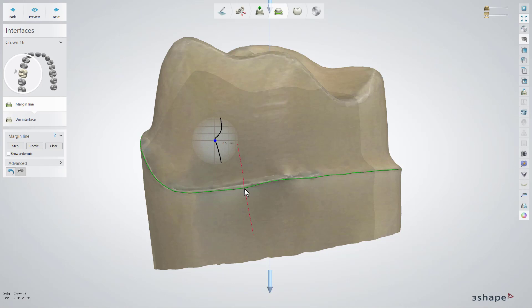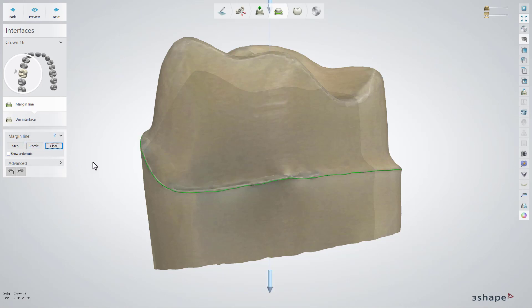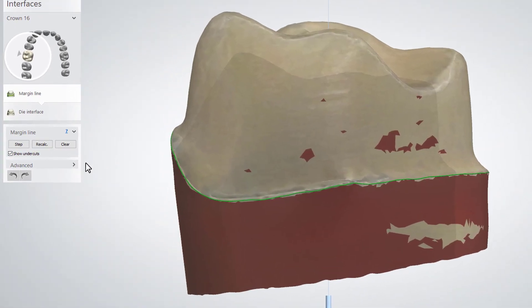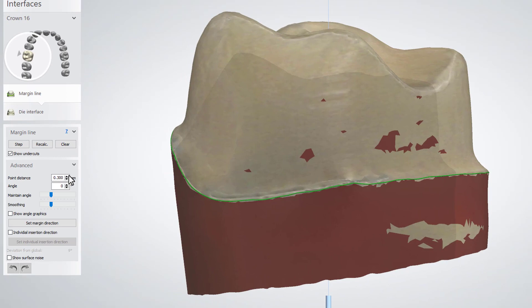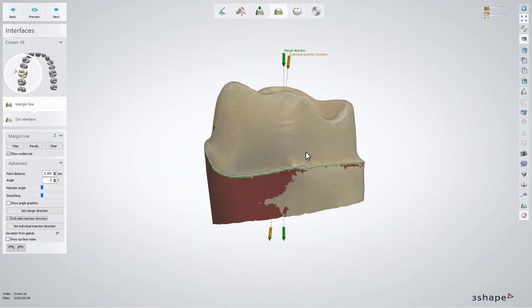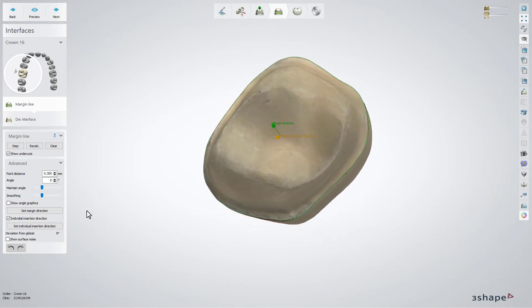To get a new estimate of the margin line, click the Recalculate button. Choose Clear to start the placement manually. Check Show Undercuts to view the undercut areas. In the Advanced Settings, you can define the distance between the points. You can also check the option Individual Insertion Direction to set the alternative direction to the individual dies, which can be helpful while designing certain bridge cases.